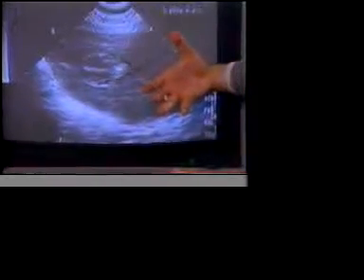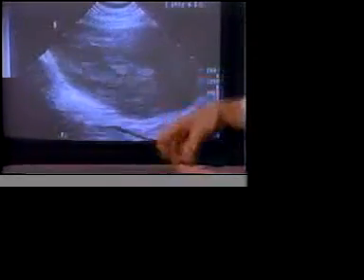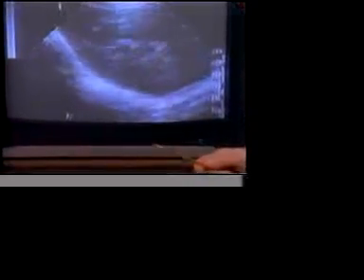The abortionist is going to have to employ this instrument, the polyp forceps, in an attempt to grab the head. The abortionist will attempt to crush the head with this instrument in this manner and remove the head piecemeal from the uterus.